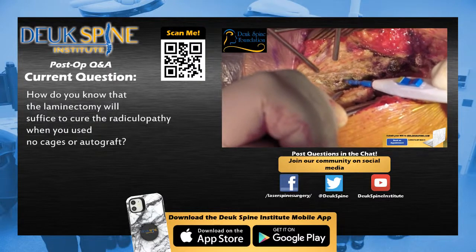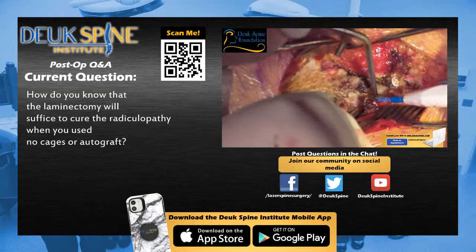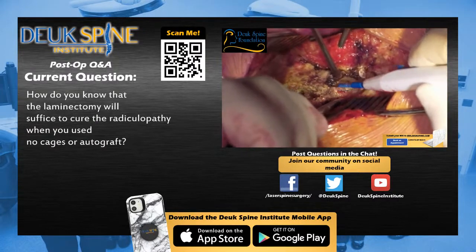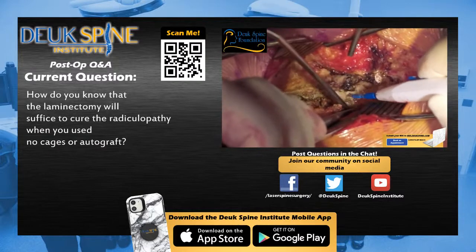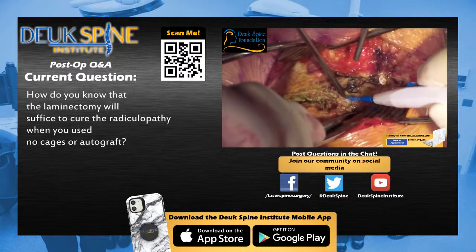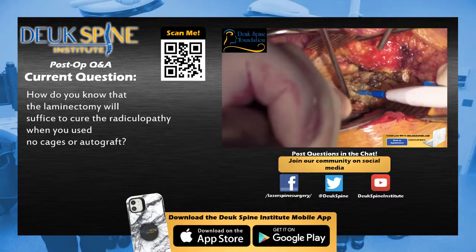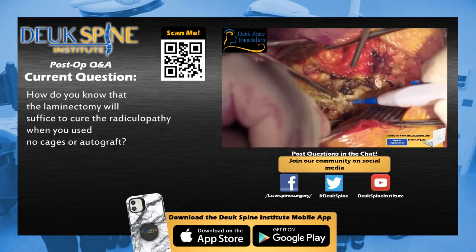And combined with the autograft that we morselized, the local autograft, which had stem cells and stuff in it, we were able to combine the allograft and autograft together. That's what I packed in. If you remember, near the end of the surgery, I was putting something back in the spine off to the side, and that was the graft material right after I drilled.